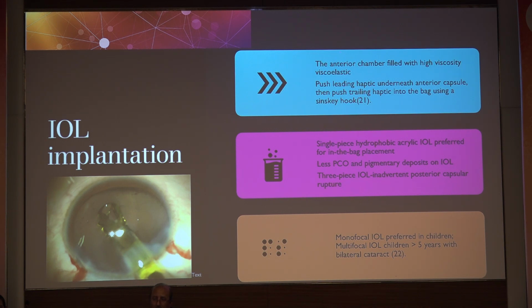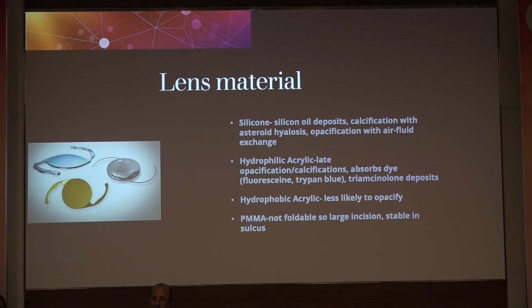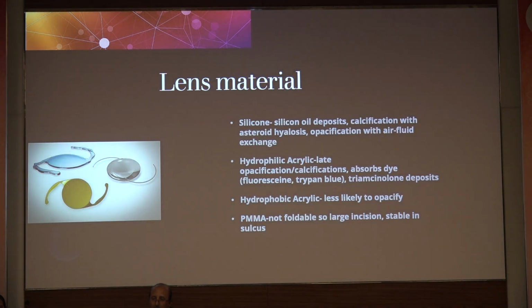Monofocal IOL is preferred in children. However, multifocal IOL can be implanted in children more than 5 years of age with bilateral cataracts. So what should be the lens material?